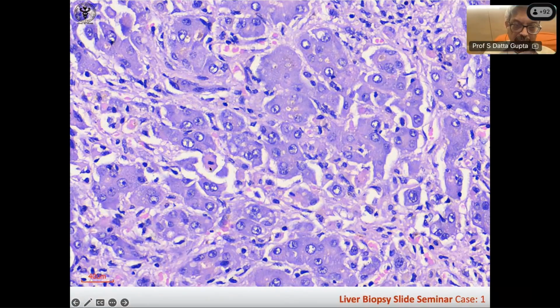Finding this, it looks like somebody has put a syringe and pulled out everything that was there, and the small nucleus. In this, the nucleus is gone. And here, what you are finding are remnants of some blood vessels like this. See, these are RBCs, RBCs, RBCs. So when you see these, you think these must have been hepatocytes here, which have become necrotic, and these are the remaining sinusoids.